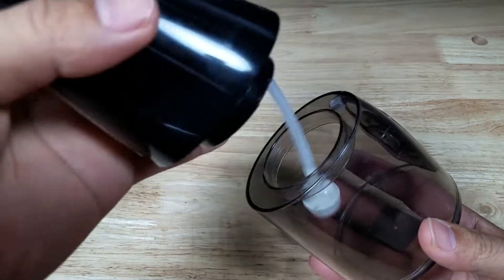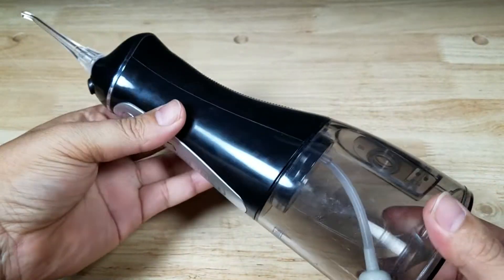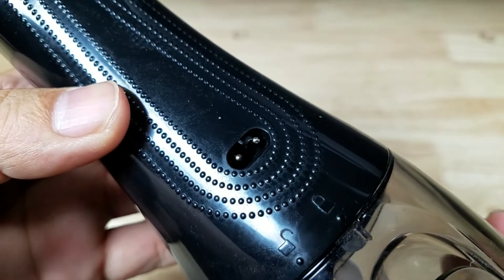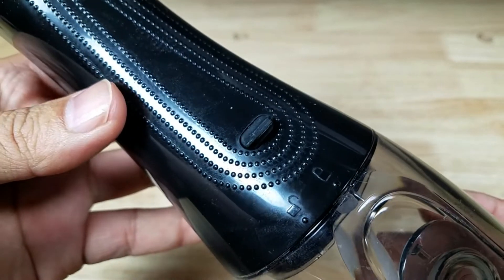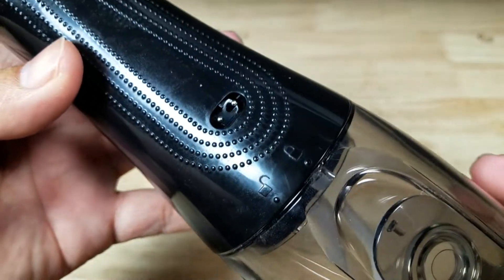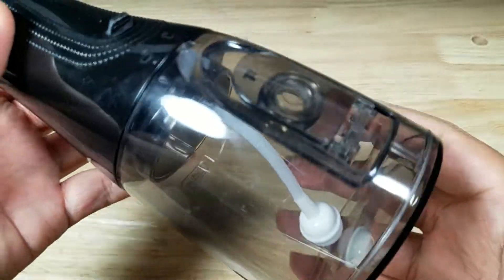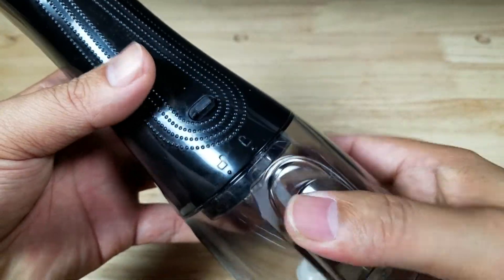Here is the reservoir and here is the pump — you just twist them together and they'll stay together securely. The charging port is here on the back. It's not USB-C, it's a special one, so you can't lose that cable — that's probably one of the only downsides. You just open up the reservoir, fill it up with water, and then you're ready to rock.